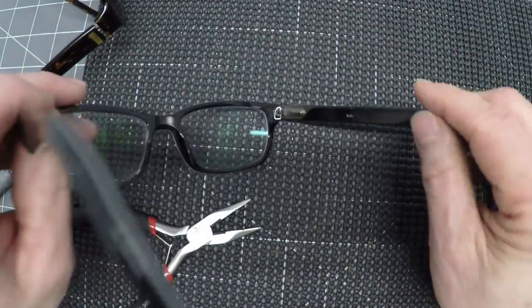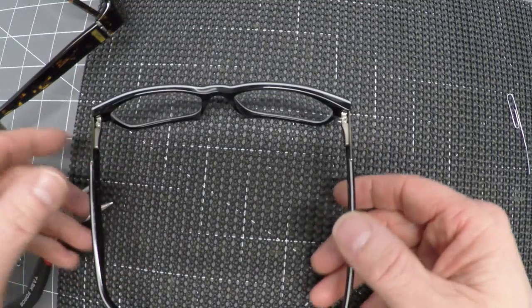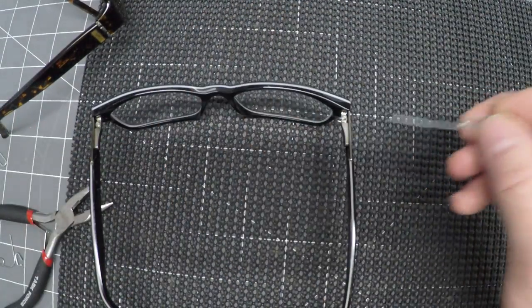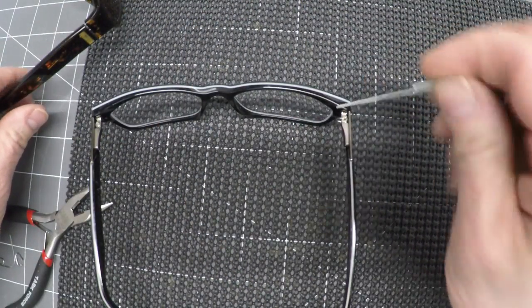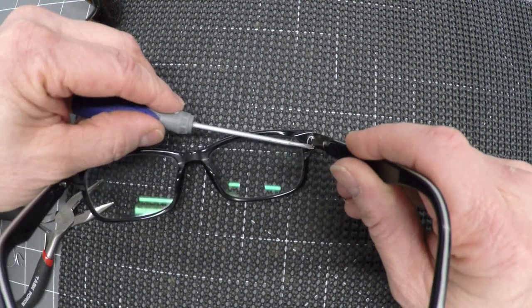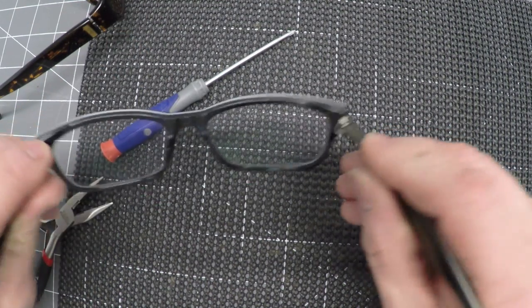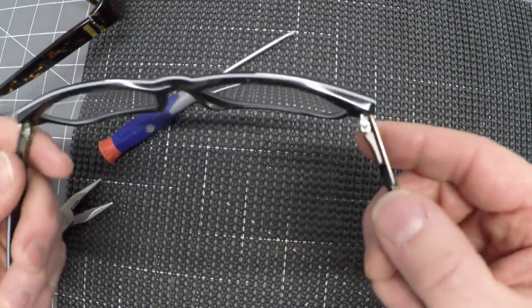Here's one I did for my son. You can see that. It's one of those spring-loaded versions of the frame, so that works too. This screw was smaller than this screw, so I actually just used the smaller paperclip in this case. Made the D, and you can see where I just had about a millimeter or so over there, and then just closed the D, and that is never gonna back out. It's never gonna come off. It's gonna last longer in the glasses.